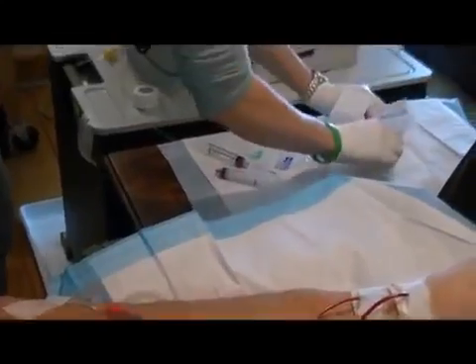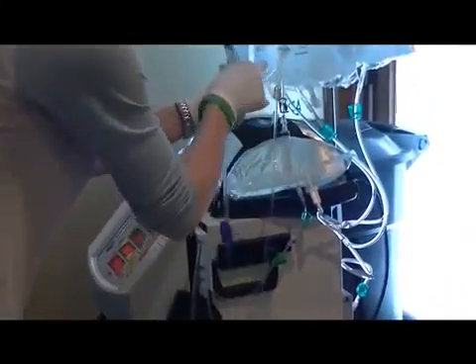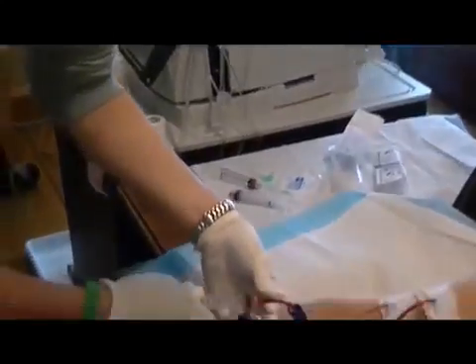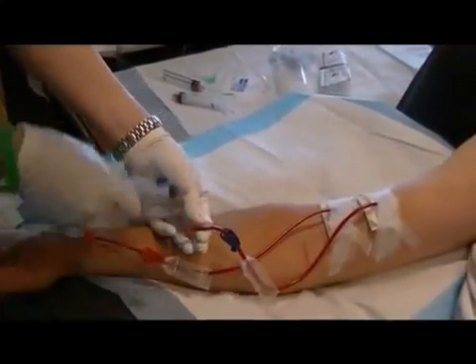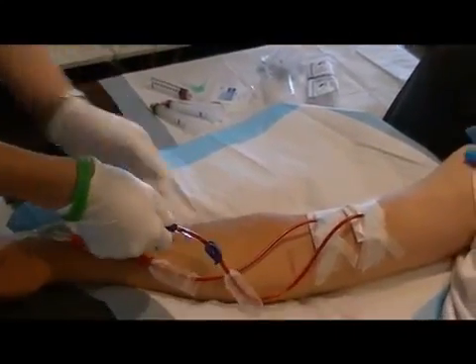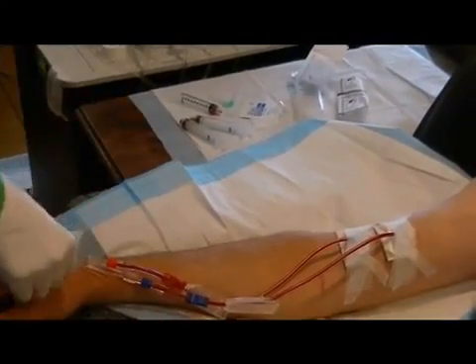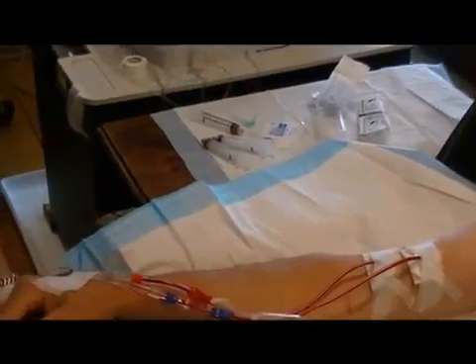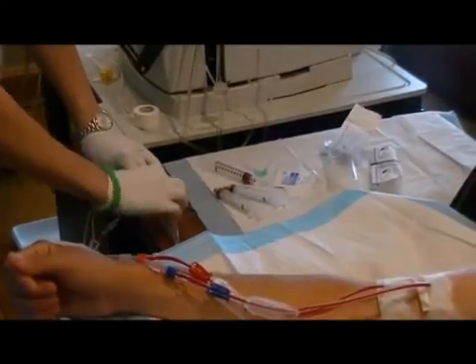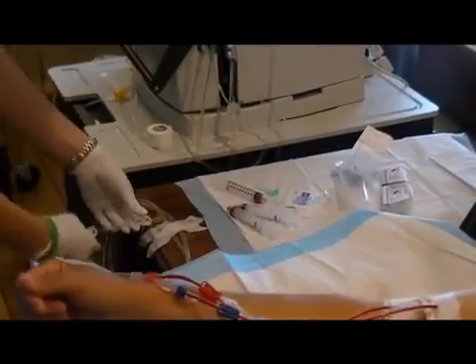Then we'll do the blue one. And you always want to make sure you've got your clamps done or you will shoot blood everywhere. Then just so the lines aren't hanging, pulling on it, you tape them up to the table. And then you double check your machine and everything, and your white clamps are always closed.